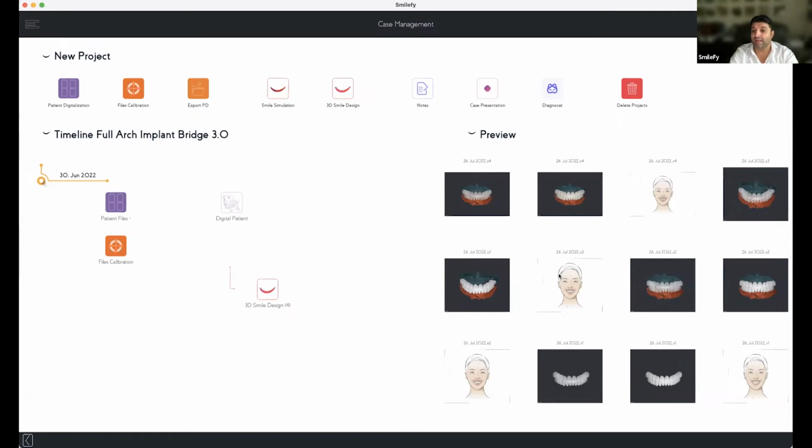So that's going to be exciting, but the technology of the facial scan really needs to get better, because for 4 years now, everybody is struggling and the mouth area is not good enough.